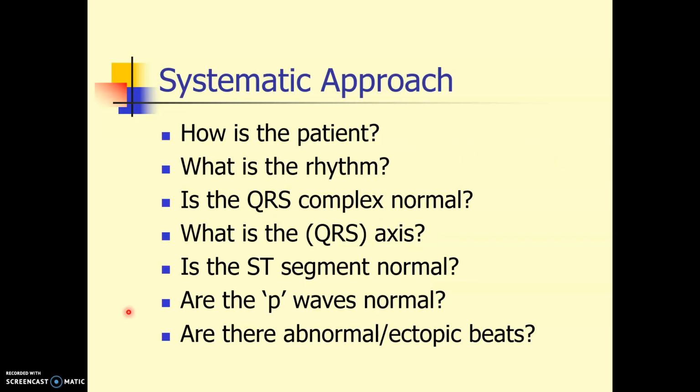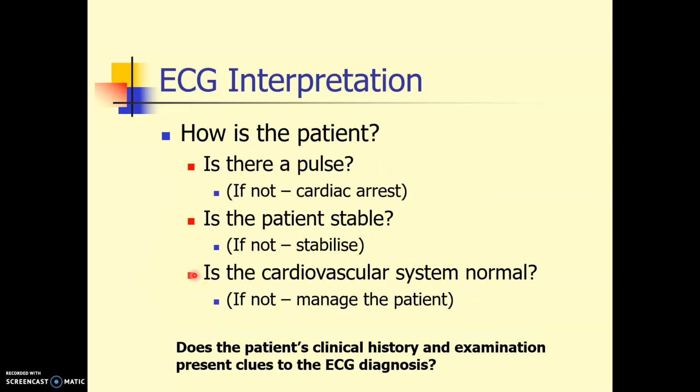Just reminding us of the systematic approach that we spoke about earlier, and for today's lecture we're going to talk about the ST segment. Bear in mind, even in this situation, we must look at our patient first, find out if they have a pulse and whether we need to start cardiac arrest management, figure out if they're stable, and focus on stabilizing the patient before we pore over the ECG.